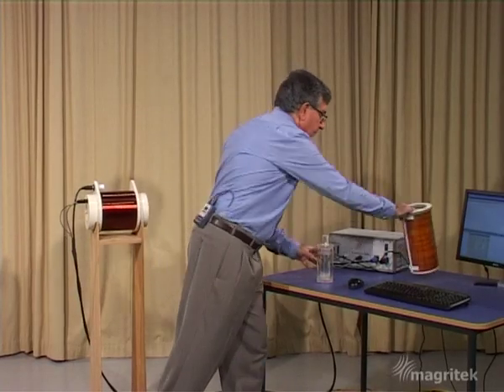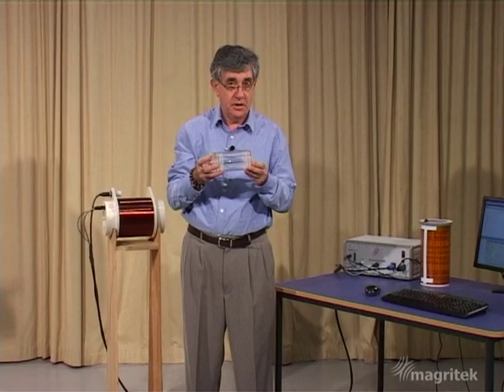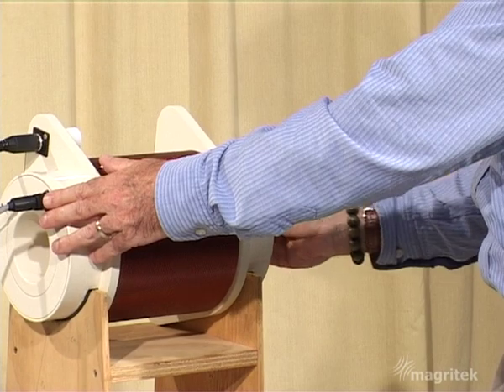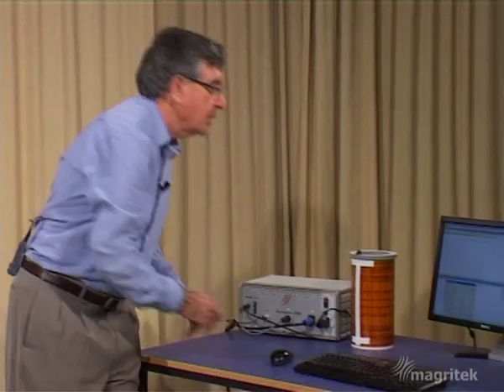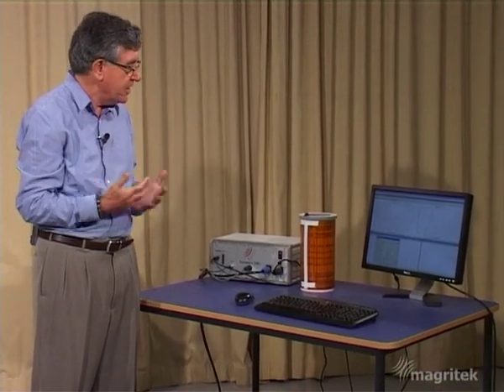So now we're going to do the MRI experiment. First I need to put the two tubes of water into the probe, and now I'll run the experiment. Pre-polarizing pulse and then the spin echo sequence under the influence of the gradient.